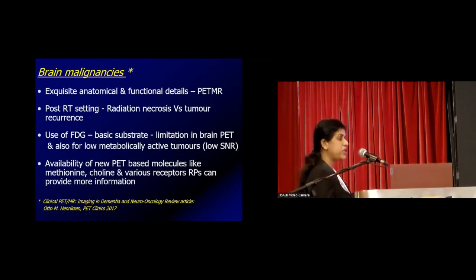Only when there is FDG avidity in the site suspected to have the lesion, we see an increased FDG avidity, which can clearly be said to be not a radiation necrosis, but rather a tumor recurrence.